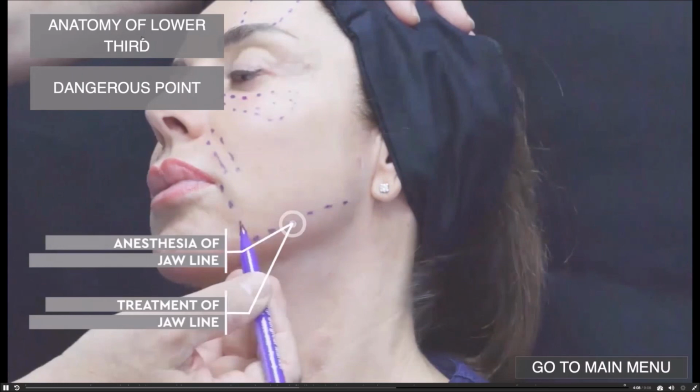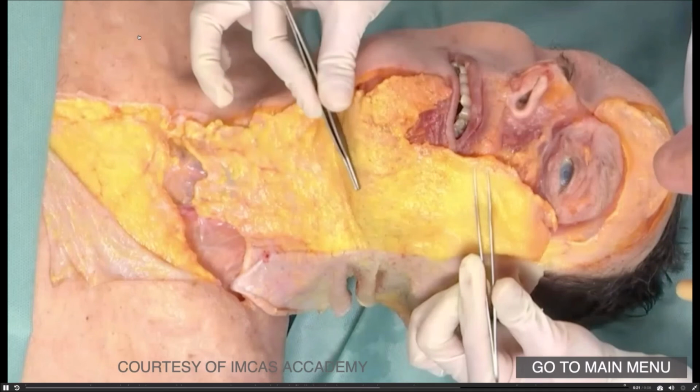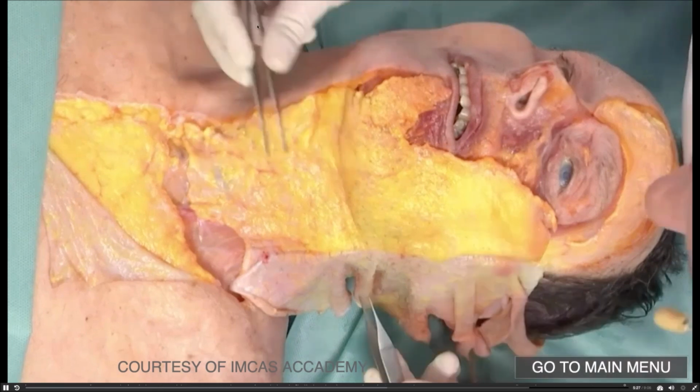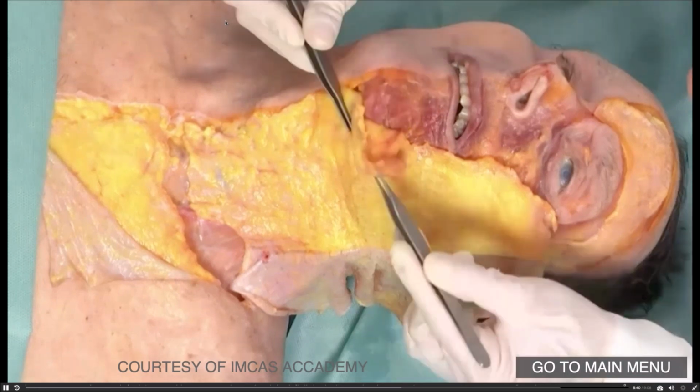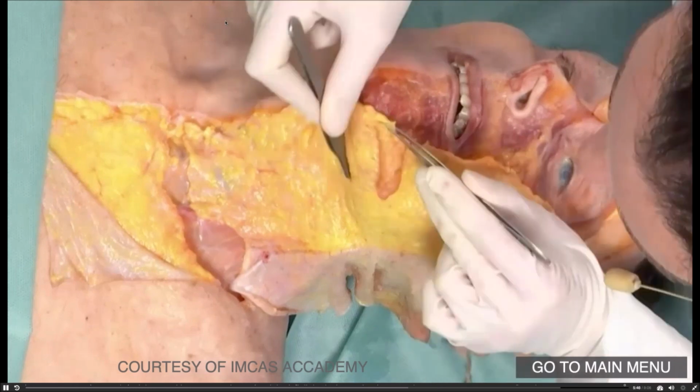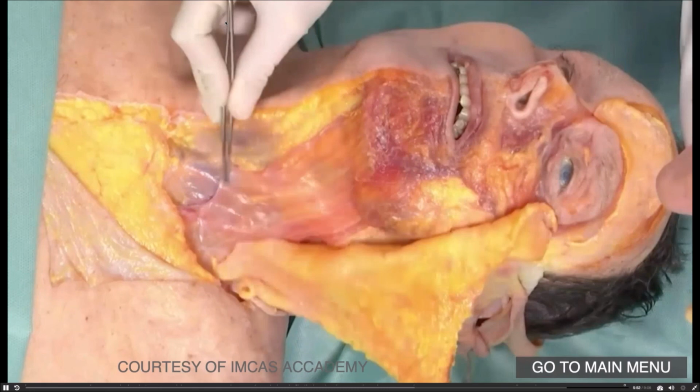The superficial fat is just fibrous, much more fibrous along the line of the mandibular edge. And you can see in a perfect definition what fat you are treating with AccuTite, and so this section of fat, and so everything you need to see what you are treating, where you are doing. Now you can see the platysmal muscles, and you can see all the points, what's happening, and all what you need.